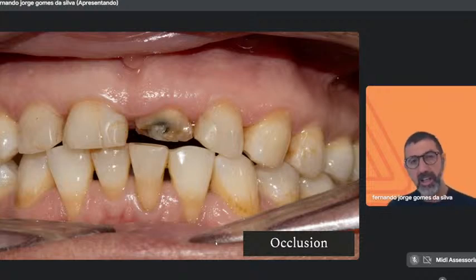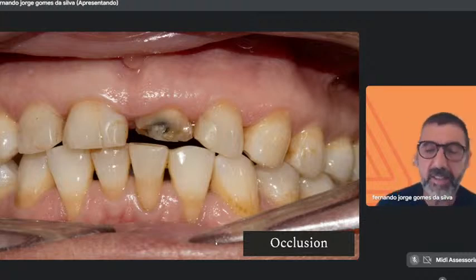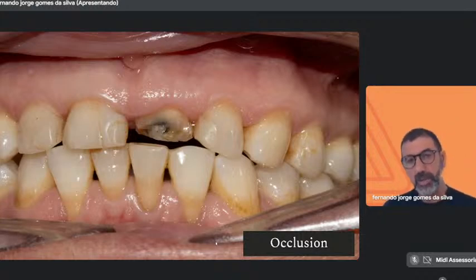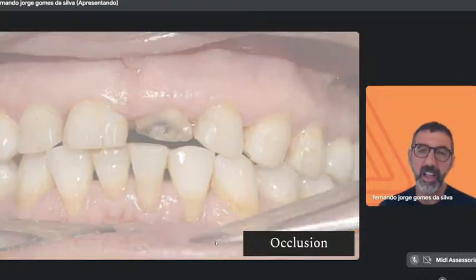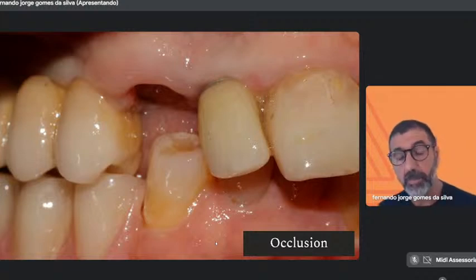This is an advantageous situation with space between them. We need some space to build our teeth, and you have to check that space and avoid any kind of contact between the provisional teeth and our opposite teeth.